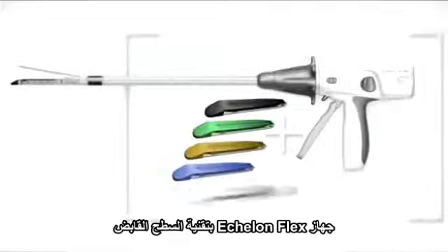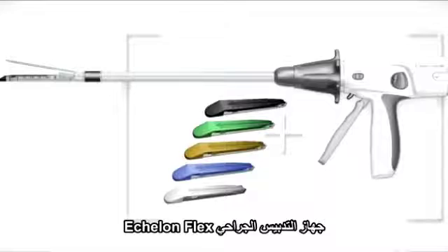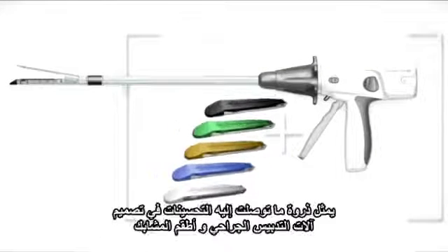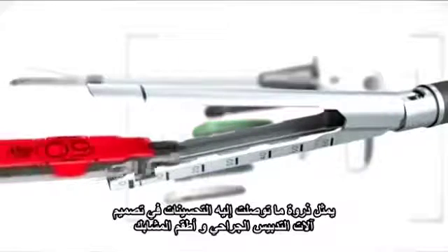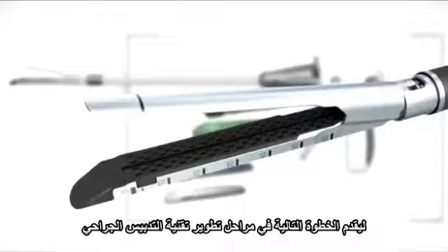The Echelon Flex GST system — the Echelon Flex Powered Plus Stapler and Endopath Echelon Reloads with Gripping Surface Technology — represents the culmination of a number of stapler and reload design enhancements to deliver the next step in the evolution of stapling technology.